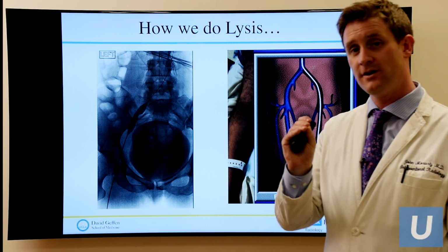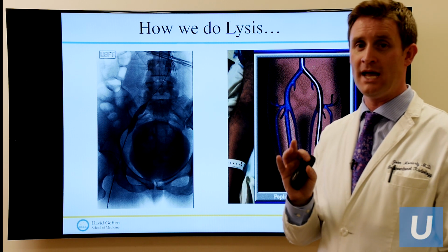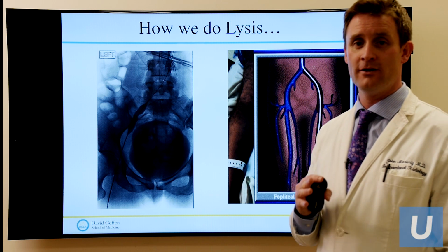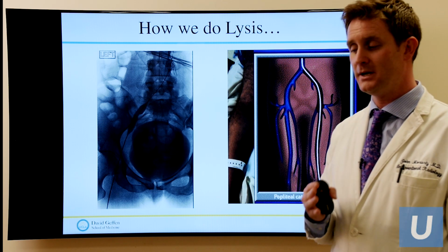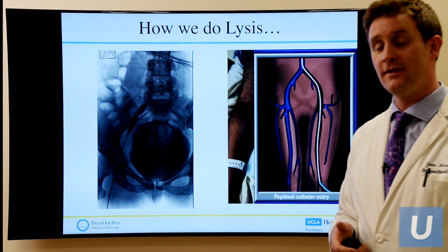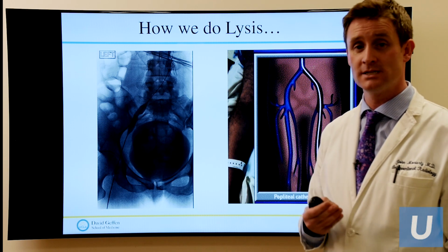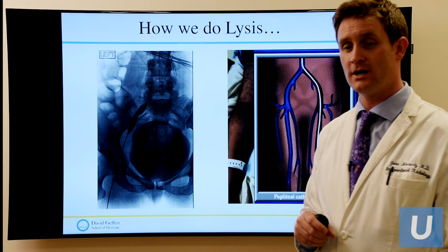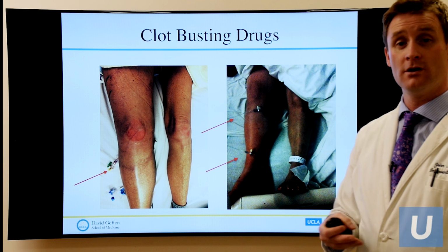And then we pass this very small tube, much smaller than a pen, navigating our way into the clot, around the areas that have been damaged, and up into the veins of your pelvis and chest. And then we put in this aggressive clot-busting agent that breaks up the clot over a period of usually 24 hours. And then the next day, we're hopefully finished.